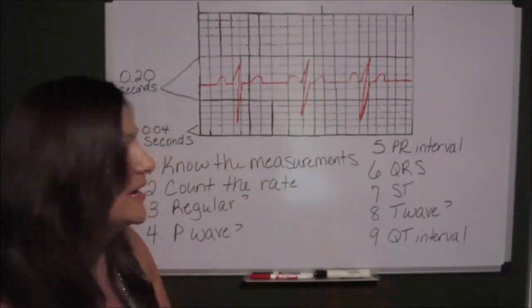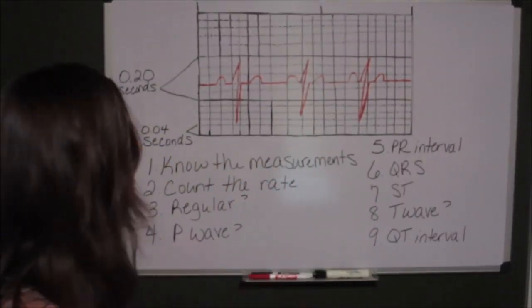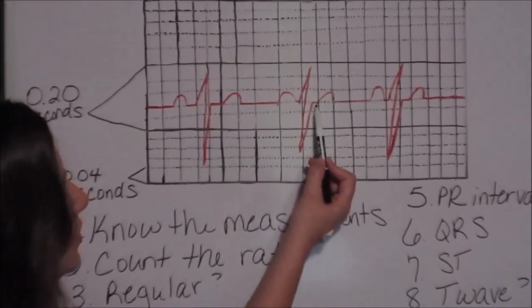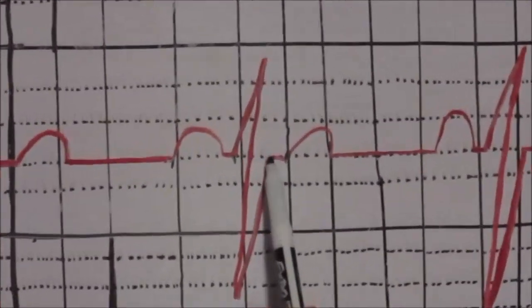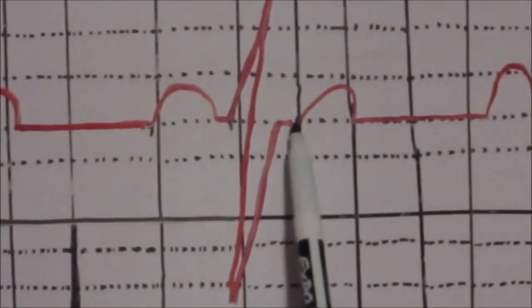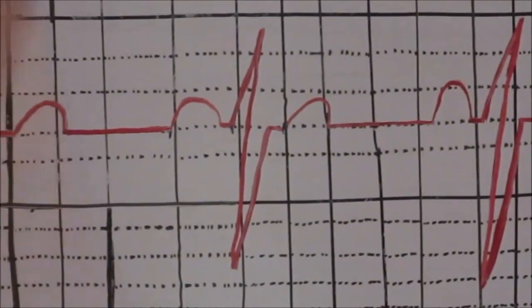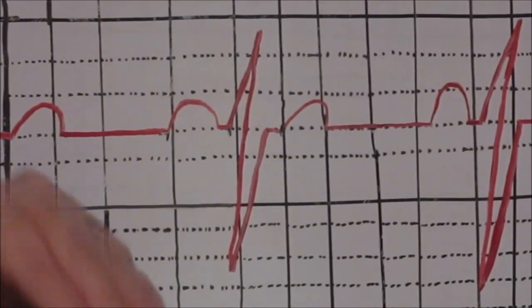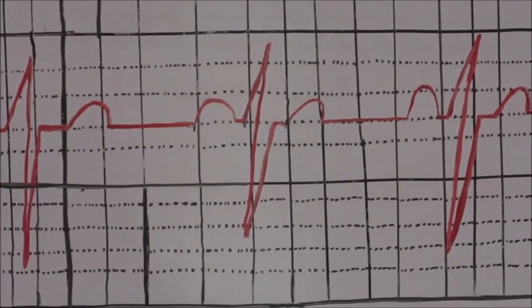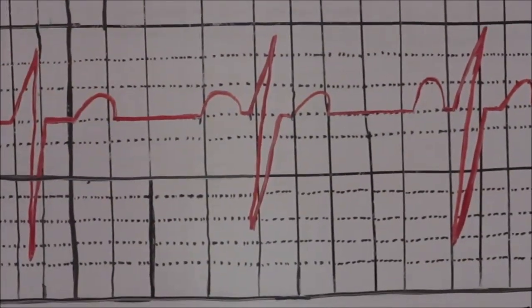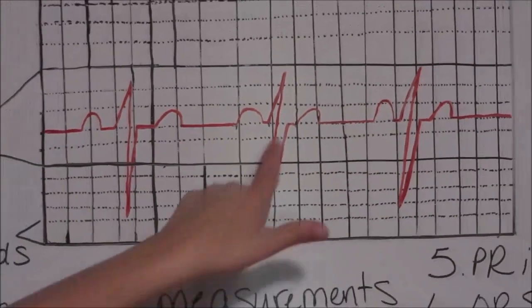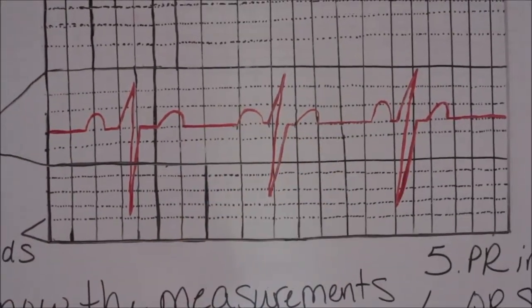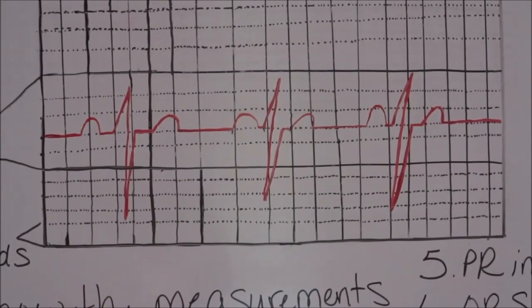Number 7. We're going to look at the ST segment. That's just the short little segment in between where the S wave comes back up to the isoelectric line to where the T wave starts to leave it. If it is depressed or elevated, then that's going to indicate ischemia or infarction. Our ST segment here is great, no problems.